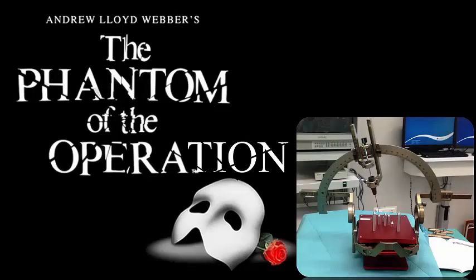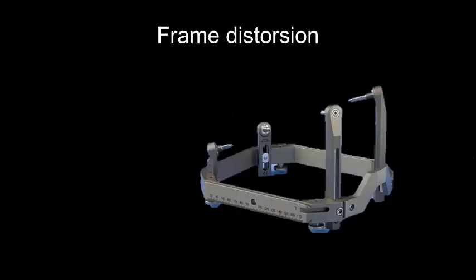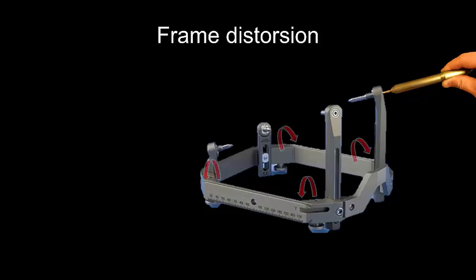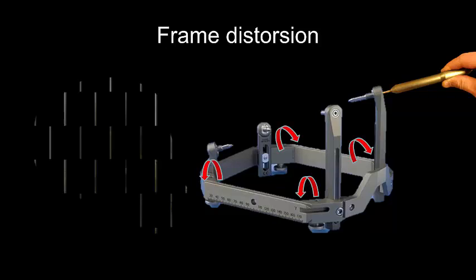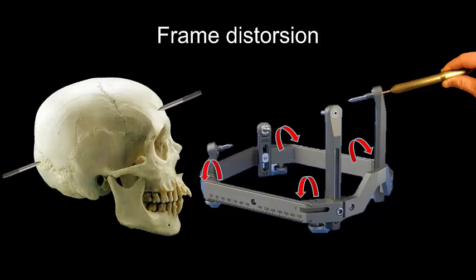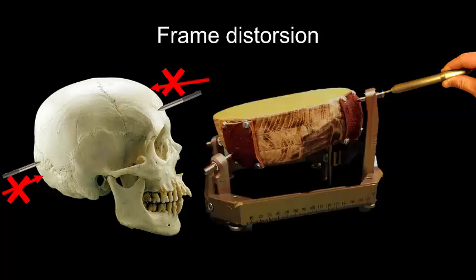We can, of course, use a phantom in order to evaluate the accuracy of the frame that we are using. Unfortunately, this does not take into account the distortion of the frame which can appear when the screws are applied to the head. This appears if the screws are tightened too much, and it is most pronounced if the screws are applied to the more slanting areas of the skull. This can quite easily be demonstrated using a model of the head.